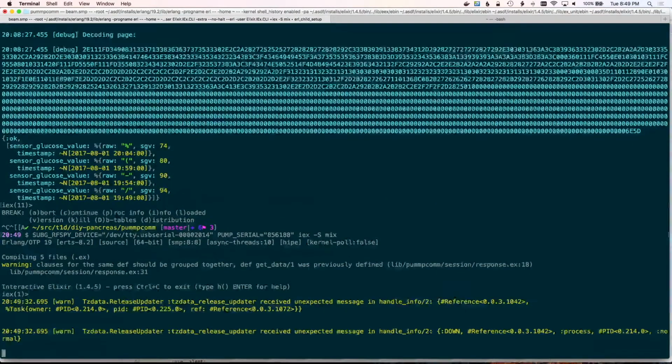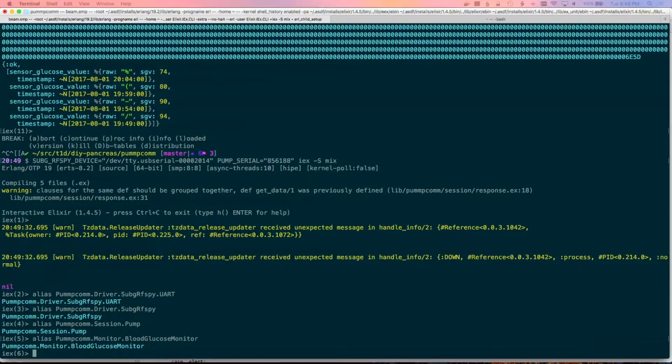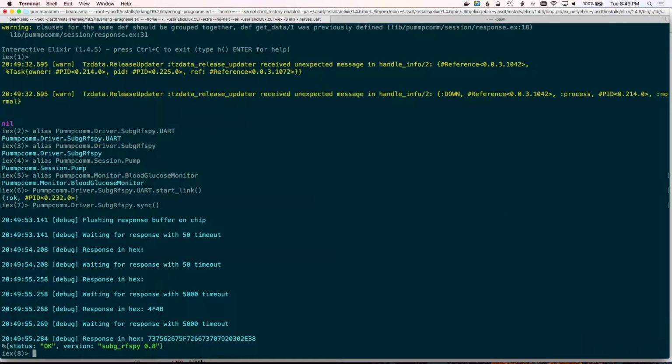So inside my IEX console, I'm just going to alias a few things to make it easier. And the very next thing that I'm going to do is start a link with the serial driver. That'll give me the information that I need then to turn around and ask the chip itself, not the insulin pump, but the chip that I'm working with, what version of history do you have, or what version of the firmware do you have in order to talk to the pump and get history and things like that.